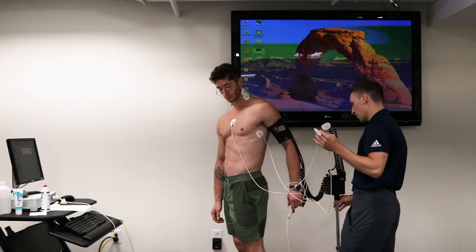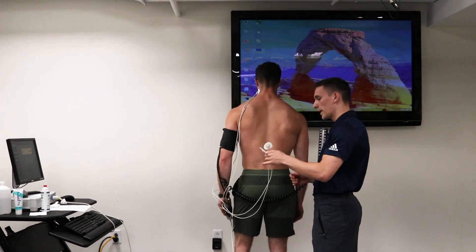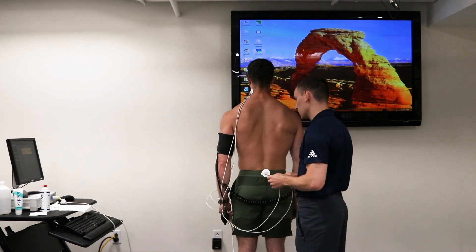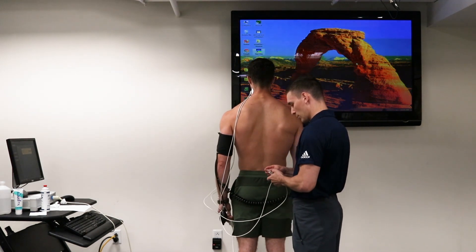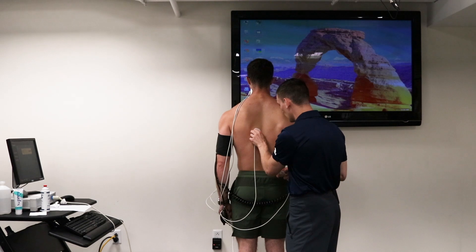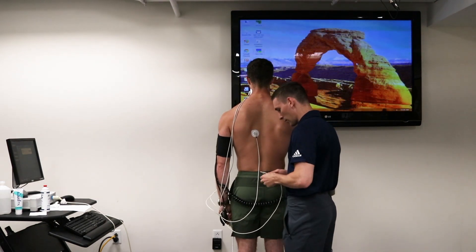Finally, we'll come around to the back. We've got our green and our black — the black will be on the bottom and the green will be on top. A good way to remember that is grass on top of dirt. Go ahead and put the black electrode on first, followed by the green.